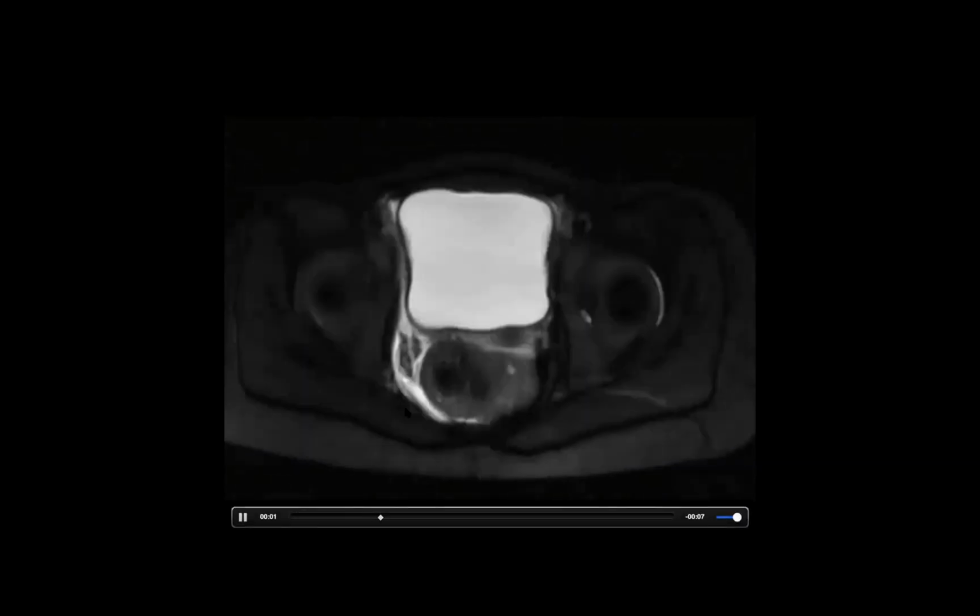And here's the equivalent MR. Again, you'll notice here, there's a loop of bowel right here, and this loop. Both of these are abnormal. One of the interesting things about this is normally in the bowel, you should not see this brightness within the wall, right? So there's significant thickening of the wall and edema within the wall of this loop of bowel. And you shouldn't see all this fluid all around the bowel. So this is another example of a lot of inflammatory changes there. So kind of a good reason for somebody to have pain.